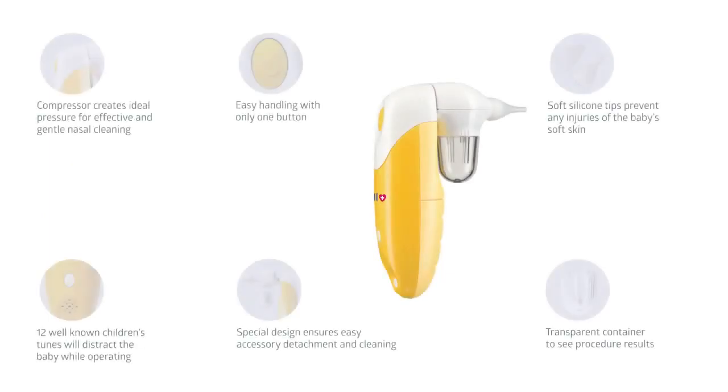The compressor creates ideal pressure for effective and gentle nasal cleaning. The device is easy to operate — just press one button. Soft silicone tips are comfortable and safe. Twelve children's melodies will distract the baby.